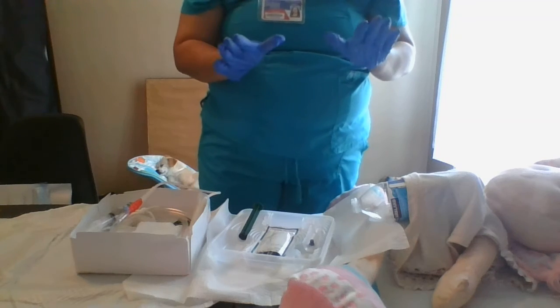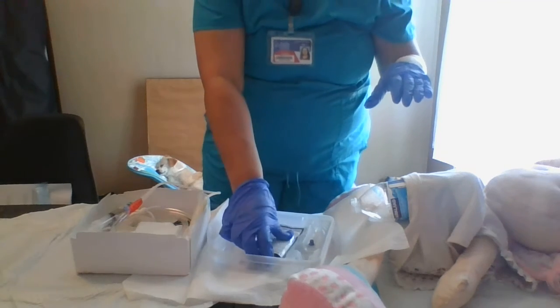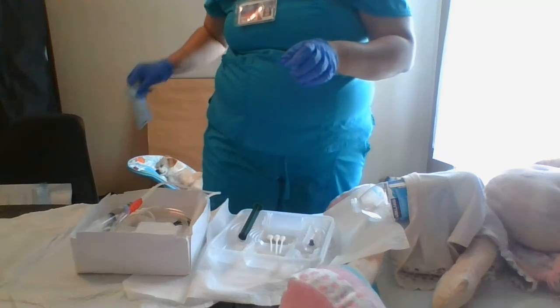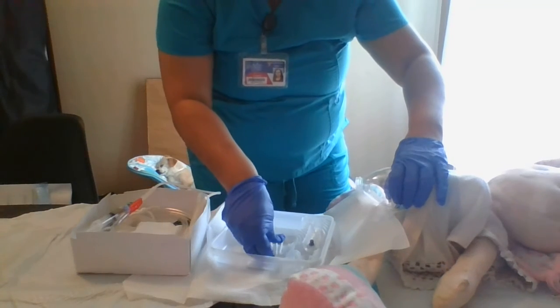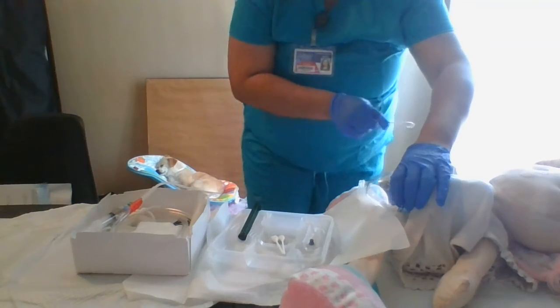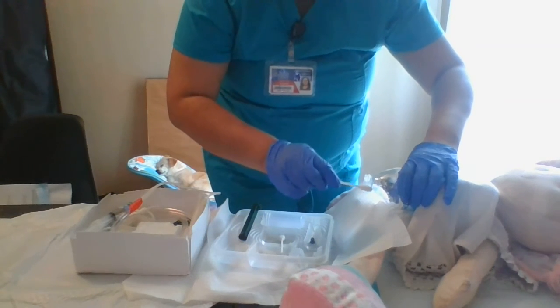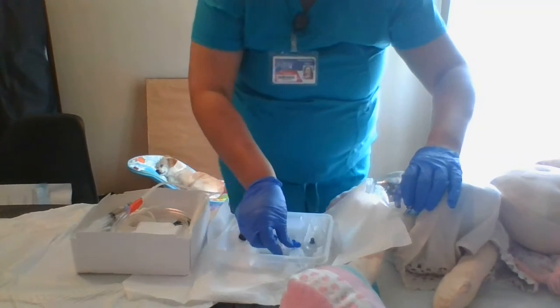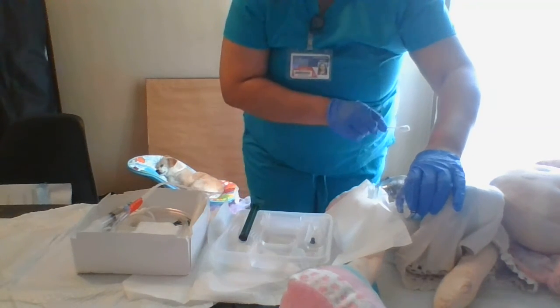I will now contaminate one hand so that I can hold the penis for cleaning. But prior to that, I will set up my 3 swabs. Now this is trash. I'm contaminating this hand. Okay, cleaning around the penis. Then I bring it out and to the side, making sure not to cross my sterile field. Out to the side. Last one. Out to the side.